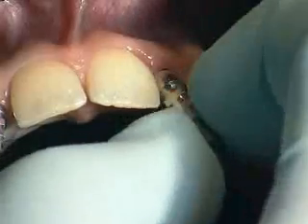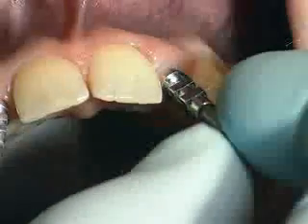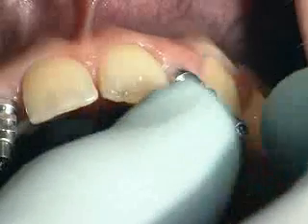Now the impression caps are placed on the implant shoulders and fastened with the integrated position screw.